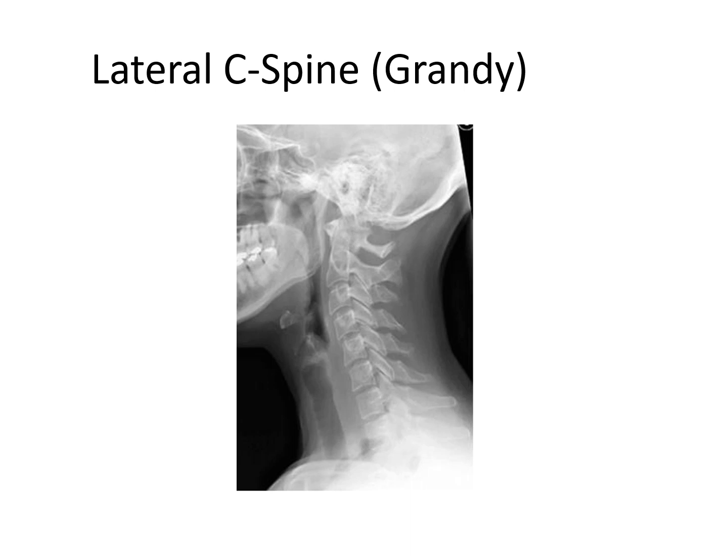You can see the EAM, the external auditory meatus, superimposed left and right. About an inch above C1, that's where I'm going to advise you cut the light field off, just above the EAM, because the EAM is the structure of the ear. It's in the base of the skull, or real close to the base of the skull. If you have the EAM in the light field, it's also on the mid-coronal plane, so it tells you where to center front to back. If you have the EAM in the light field, you definitely have C1.